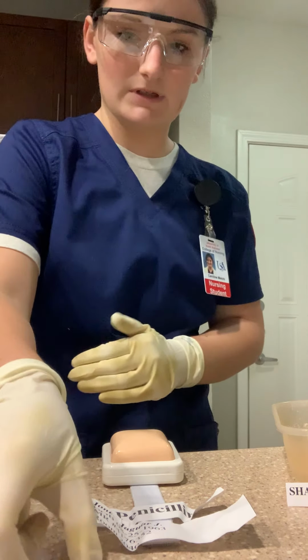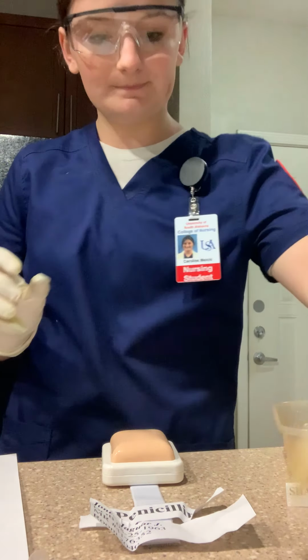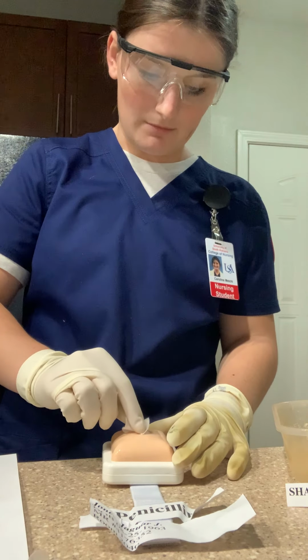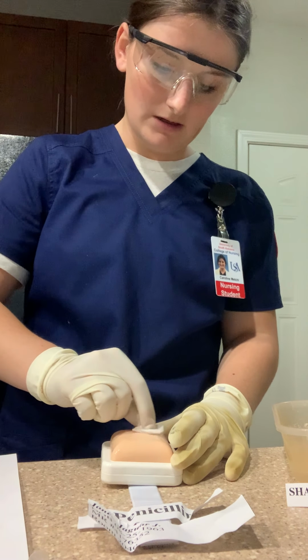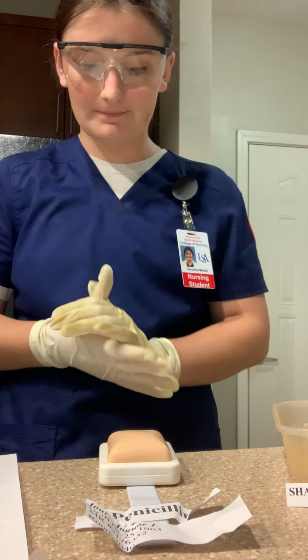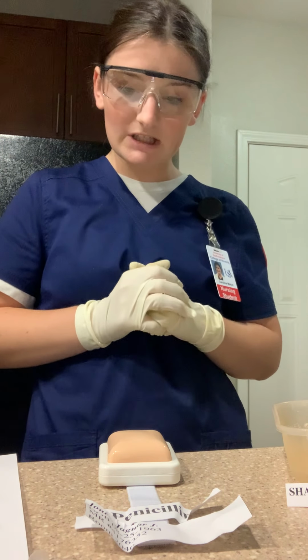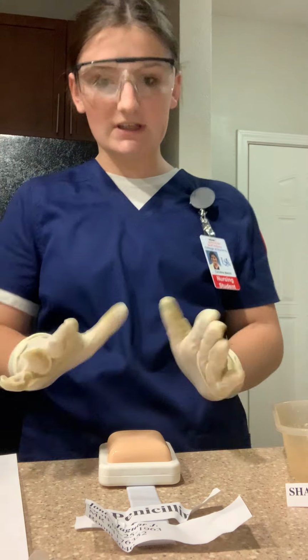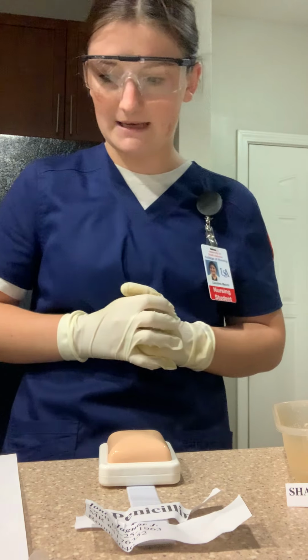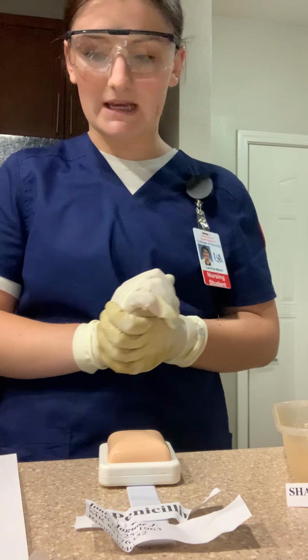So the next thing I'm going to do is clean the area. From most sterile to least, so I'm going from the center, going in a circular motion, and discarding. So Mr. Jones, I'm going to quickly explain to you the procedure. I will be giving an intramuscular injection into the injection site, which in this case is my injection pad, to help with your pain. So now that I have told him and I have cleaned, I am going to make the injection.